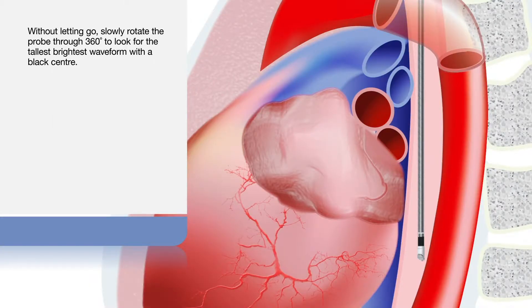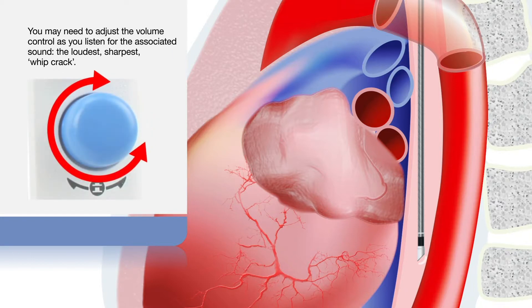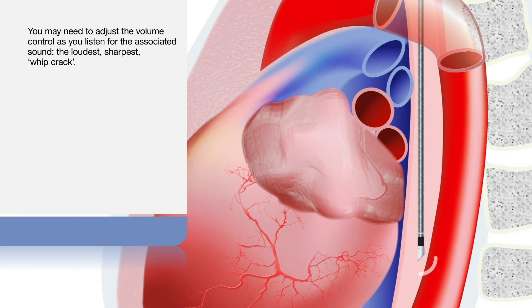Without letting go, slowly rotate the probe through 360 degrees to look for the tallest, brightest waveform with the black centre. You may need to adjust the volume control as you listen for the associated loudest, sharpest whip crack.